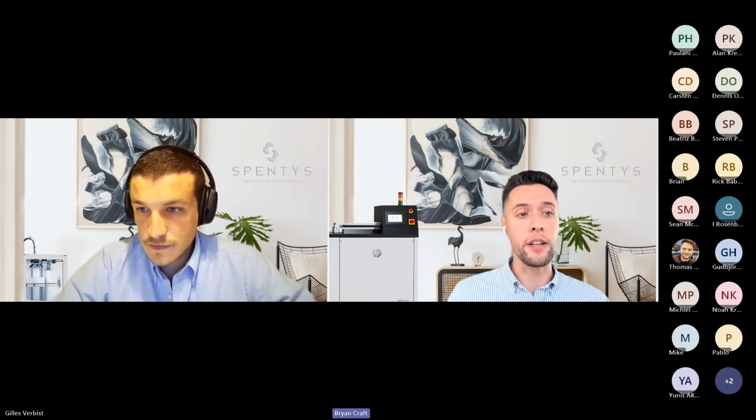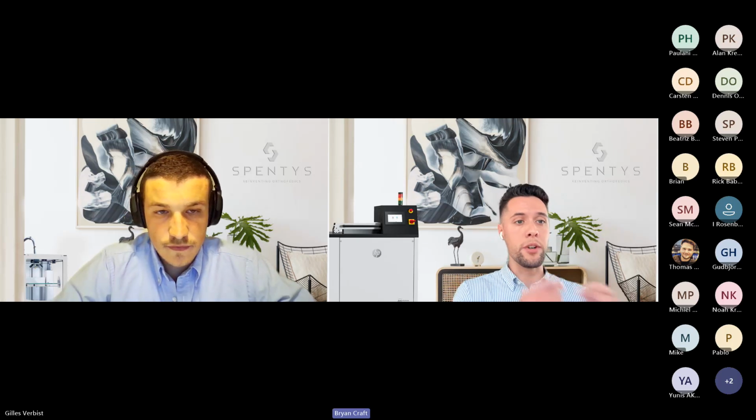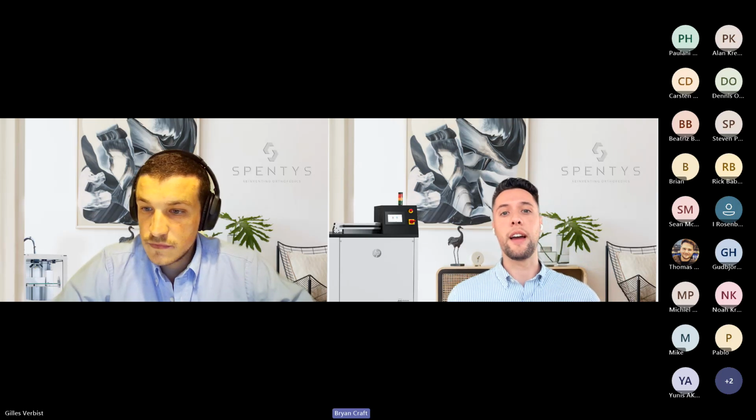And again, if you want to create your own line of 3D printed devices, with your clinical standards, your parameters, your logos, your branding, your workflow completely branded to you, you can go to your referral partners and your therapists, which Alan, I see you're a therapist yourself, and say, guys, we're innovating.